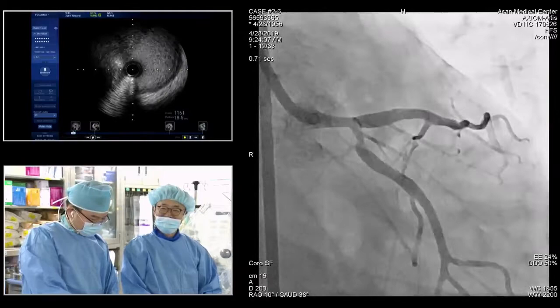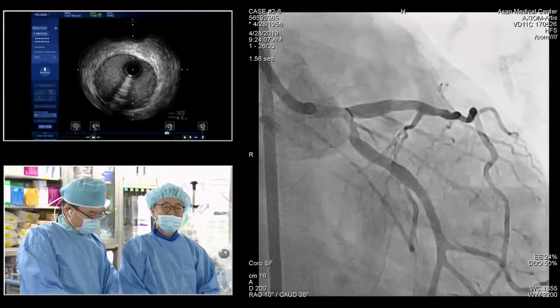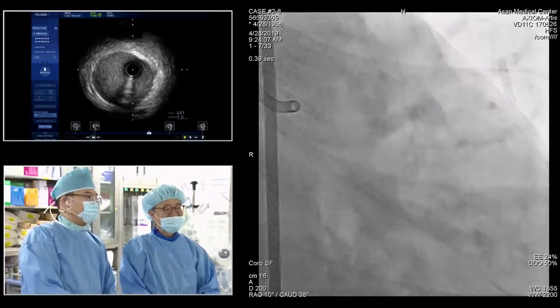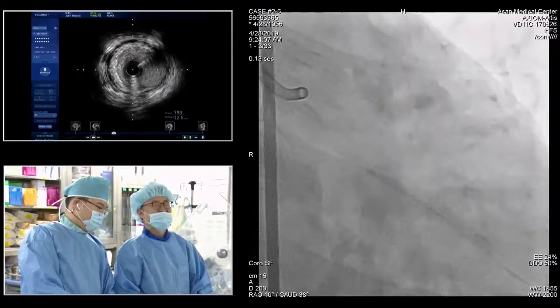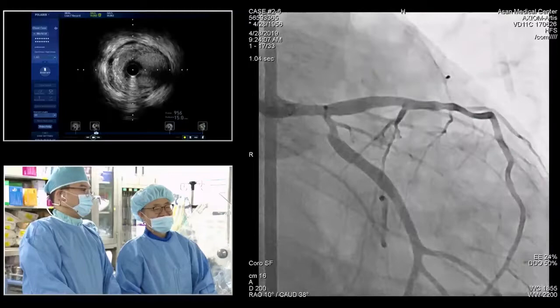I mean, but Greg, honestly, there's not much data on jailing the LAD. Right. Very little. Personally, I'm a little nervous, but that's just me. The other thing is we don't see this kind of left main disease in the U.S., where it's focal, the distal vessels are essentially not involved, and there's very little calcium. This has to be something different from what we typically see in the West.